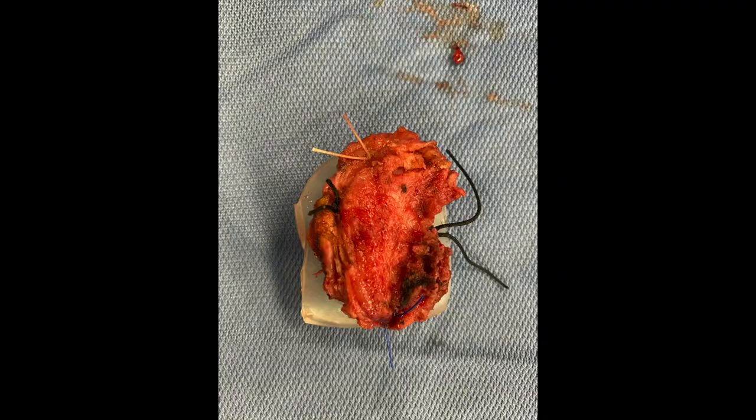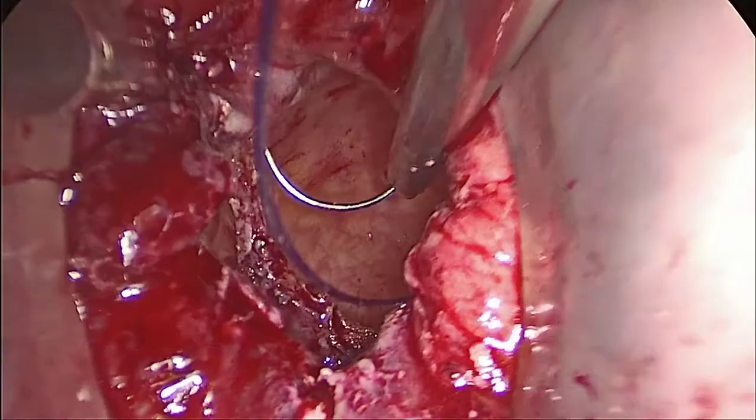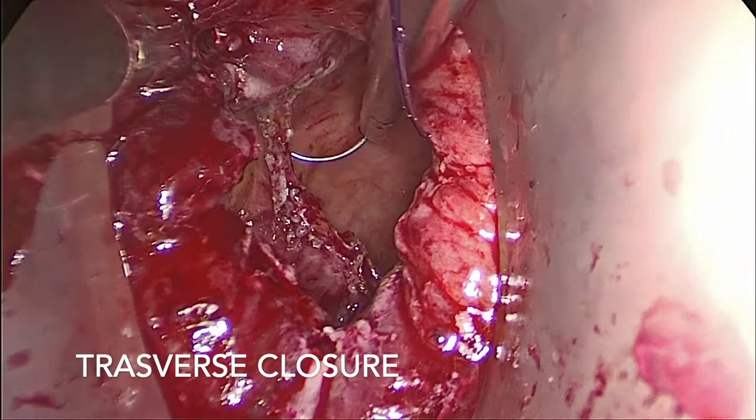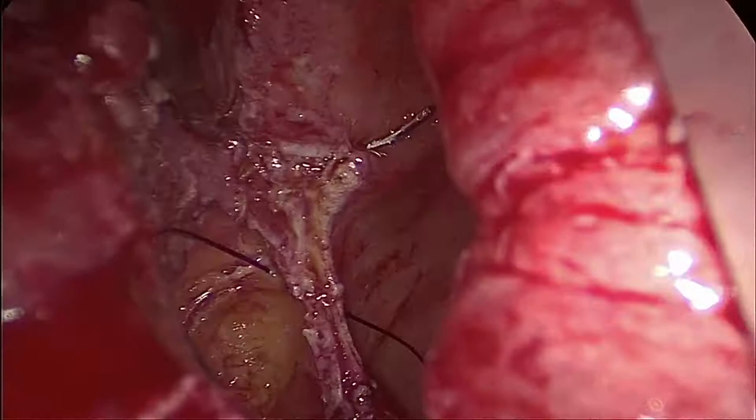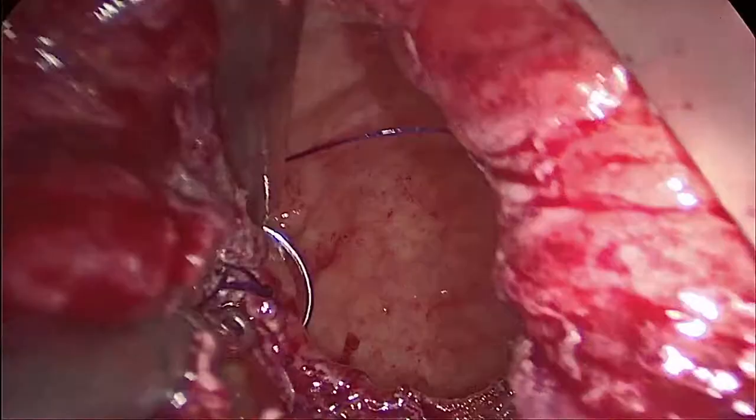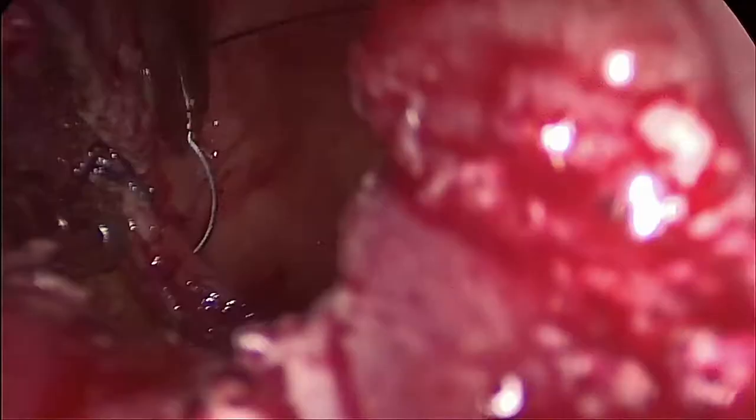After excision, the rectal wall was oriented and examined intraoperatively by pathologists to assess the margins, as we always do during TAMIS. The surgical defect was closed transversely with two semicontinuous barbed sutures of resorbable monofilament. We usually close with a single continuous.